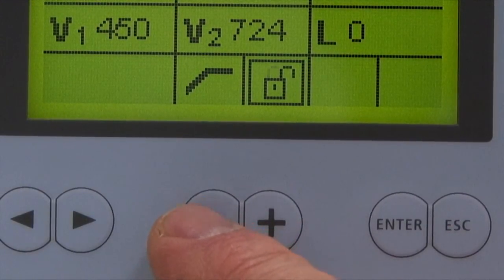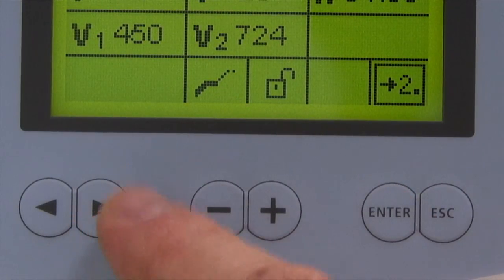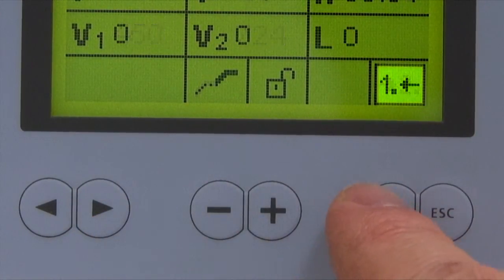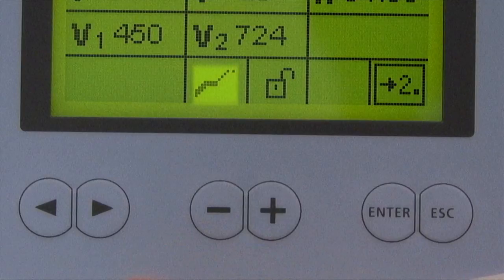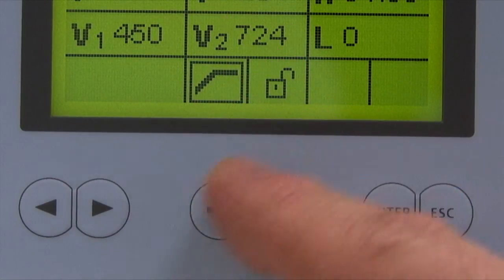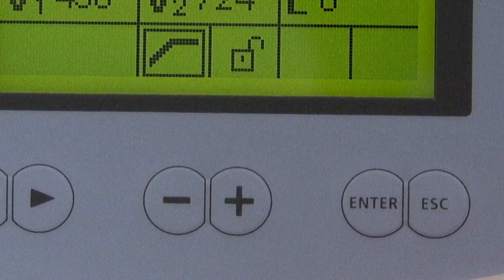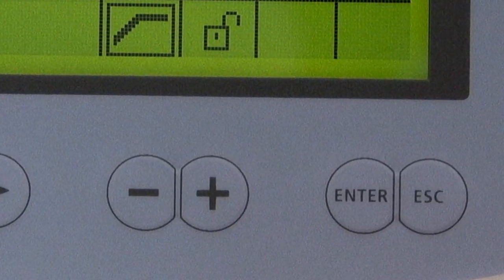If a two-stage program is used, the parameters are displayed in separate screens. To select a two-stage program, place the cursor over the change program stage indication symbol and press Enter. The lower half of the line will appear bold and the one-stage/two-stage symbol will have an arrow pointing to the number two. To toggle between the first and second-stage screen, place the cursor over the one-stage/two-stage symbol and press the minus or plus key. Once programming is complete, exit by selecting the escape key or a program key.